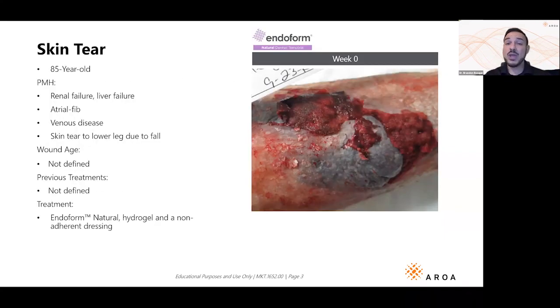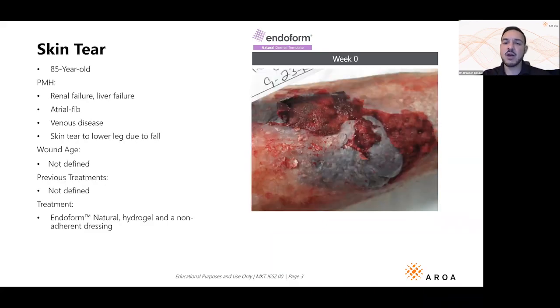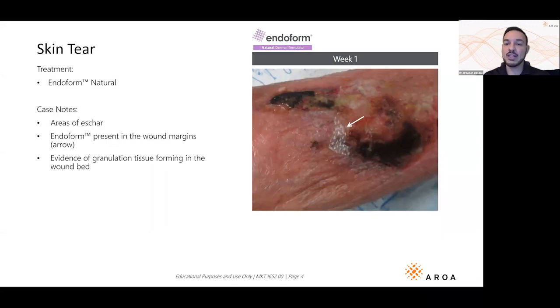So again, 1 week of applying Endoform, and you can see that that wound is already improving. You see some of those islands of eschar right there. And from the previous picture, you can see that that's not terribly surprising. Some of that soft tissue is going to kind of die off and scab over, and that's okay. But you already see that white arrow there is residual Endoform. It's kind of doing its work on the adjacent side, but some of that residual Endoform is kind of lingering around. You can see the middle part of the wound after just 1 week is already healing beautifully. And we talked about that. This is a patient that's a bit older, has some health issues, so maybe they're not going to heal as quickly as some younger and healthier patients.